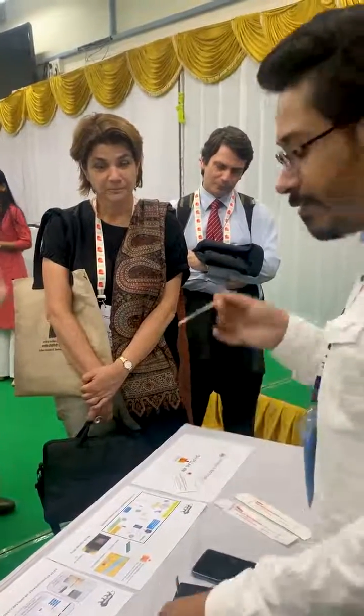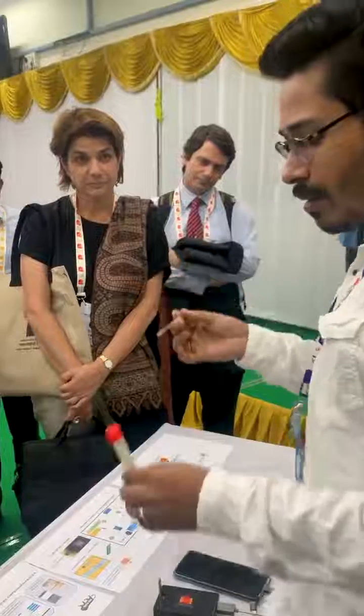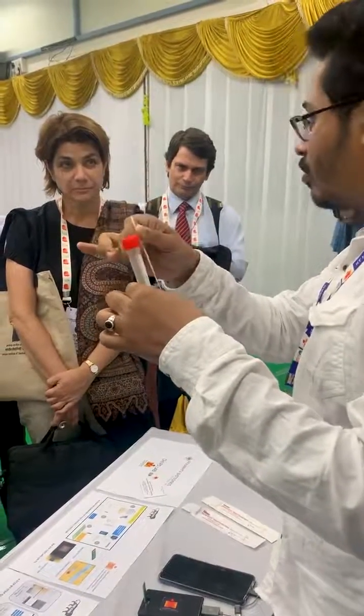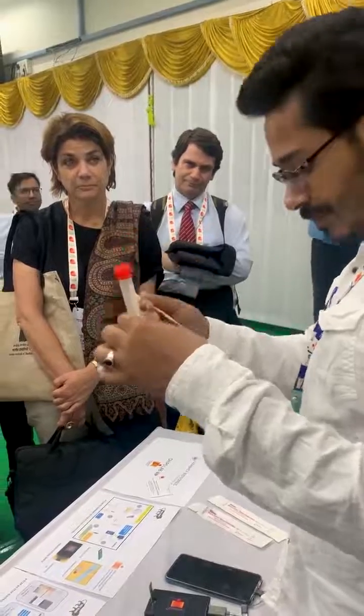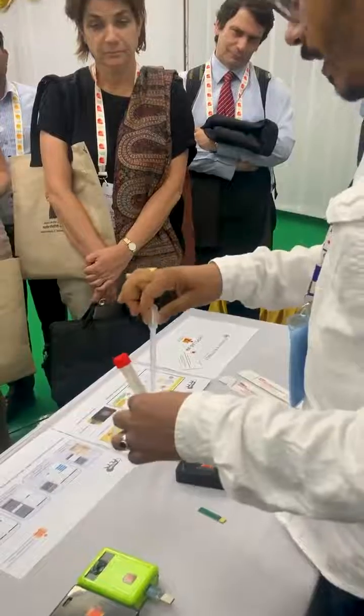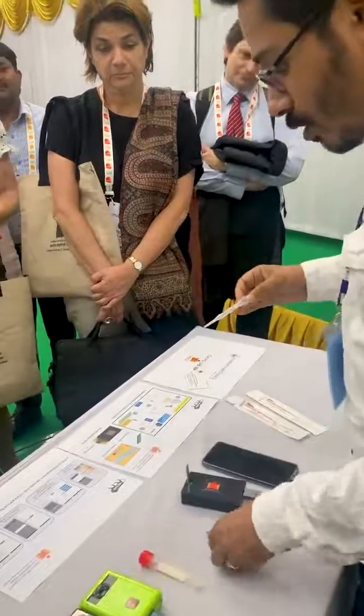We have to inactivate the virus after taking the sample. For that we have to use this buffer so that the virus gets inactivated over here and the RNA is extracted. Then we have to test the sample. We just take a little bit of sample and put it on top of the device.